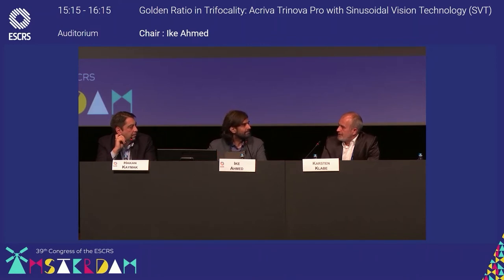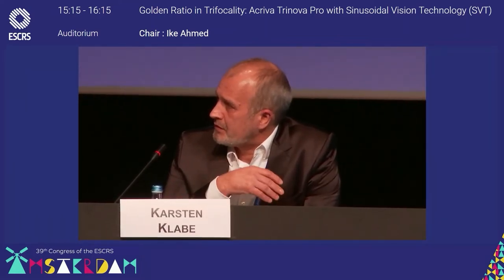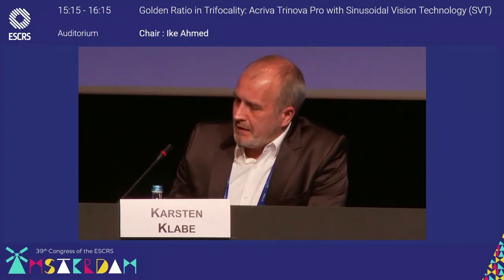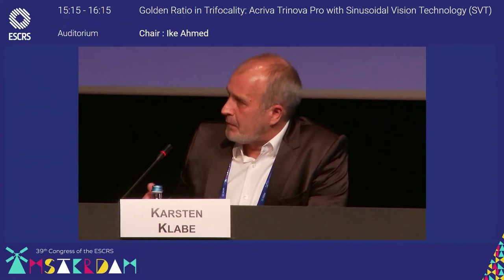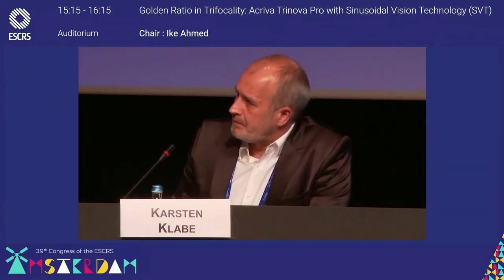I think so. We were talking 10 years ago about the optical quality of intraocular lenses. So aspheric lenses were introduced and improved the optical quality of the lenses. And with the introduction of EDOF lenses, we lowered optical quality at the end of the day. So I think the way to improve our trifocal design is the better way to treat presbyopia.